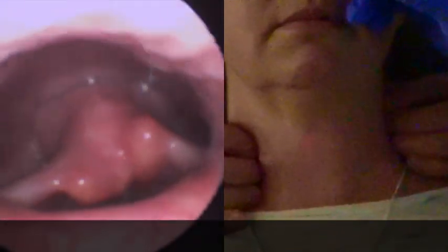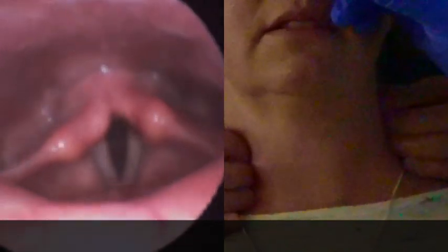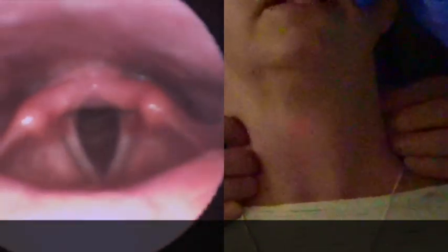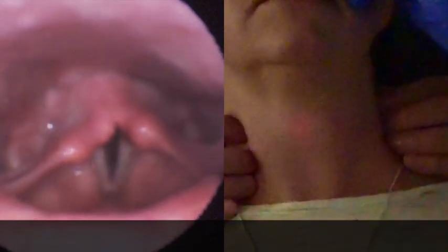Go ahead and speak or test yourself with your range. I'm not doing anything right now, that's just her. Okay, now go ahead. Can you tip your chin up for me? And then go through those ahs again. Once more. So the crossing midline movement of the right arytenoid, what do you relate that to?